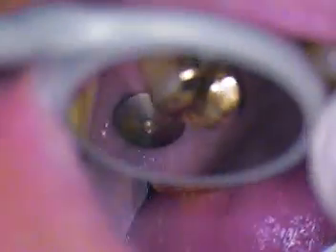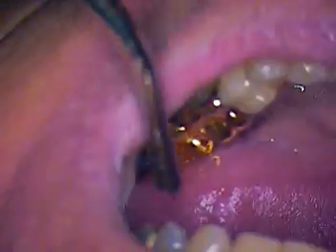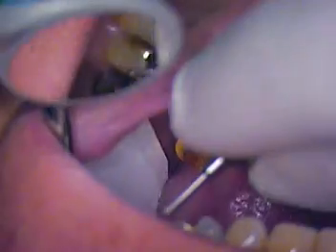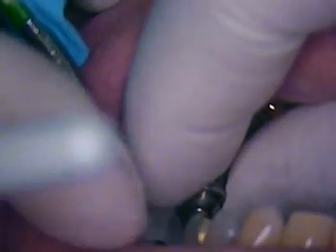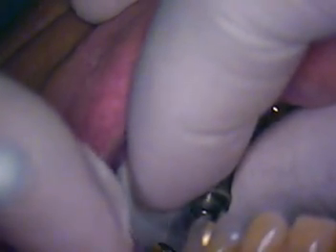Okay, so let's go ahead and we'll remove the healing abutment. Retract only. And this is a star wrench. I'm just going to insert that. Let's see if we can hand tighten that. Go a little bit more. Retract higher, please. Here.